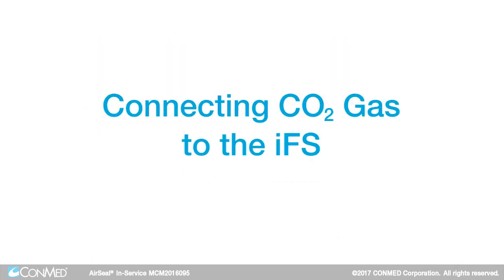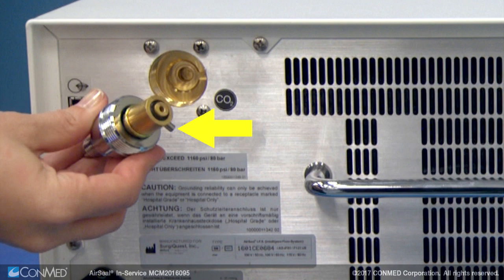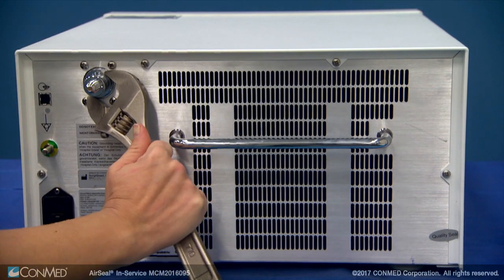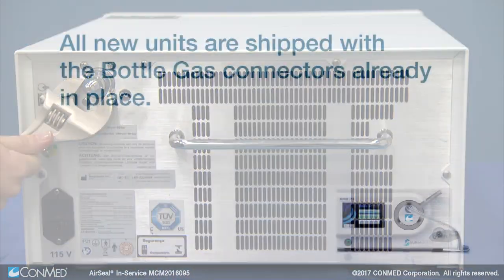When connecting CO2 gas to the IFS, ensure there is a rubber gasket on your house or bottle gas connector. Align the pin on the connector to the notch in the plug and turn until finger tight. Use a wrench to finish tightening the house or bottle gas connector.